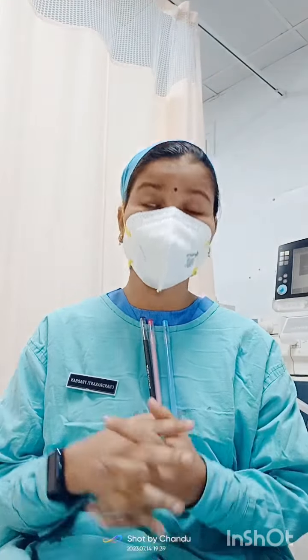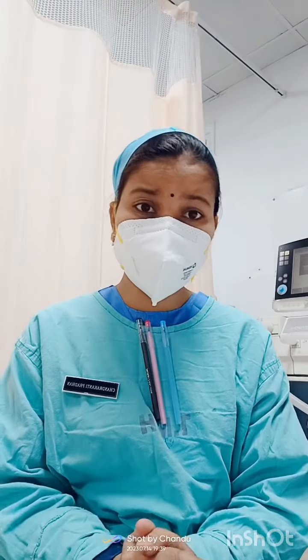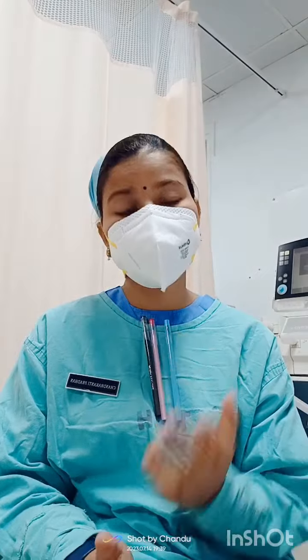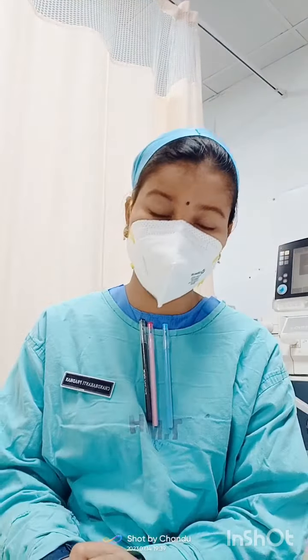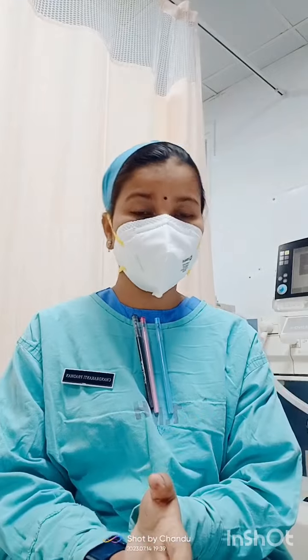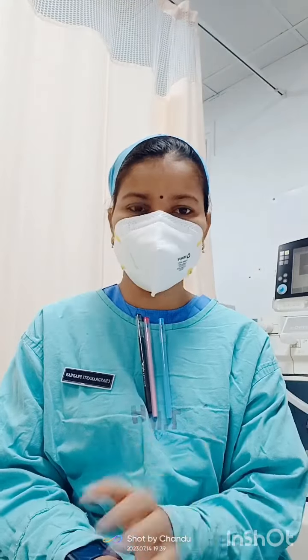Next comes the term defibrillation. Defibrillation means providing electrical energy to a patient to restart the heartbeat. Where do you use defibrillation? Only in cardiac arrest, where you find pulseless ventricular tachycardia and pulseless ventricular fibrillation. There are only two shockable rhythms, pulseless VT and pulseless VF. We can use only defibrillation in that condition.